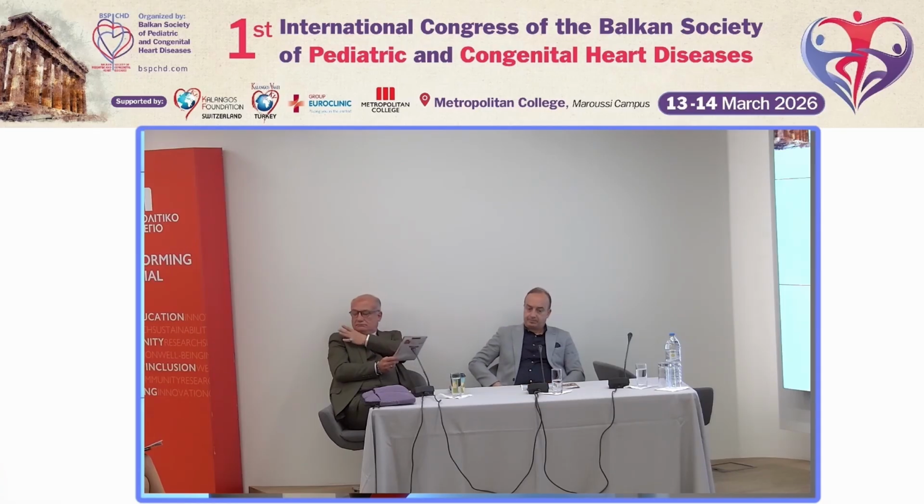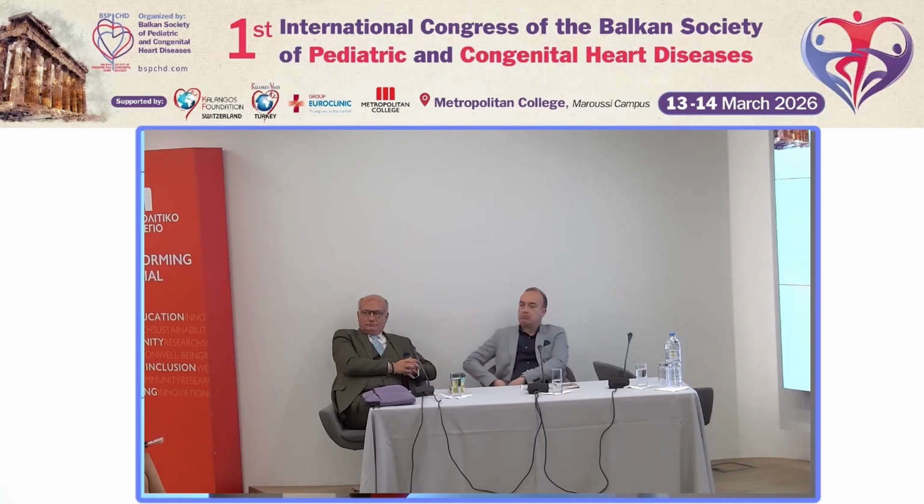And the real strength in this current era, because a lot of my presentation was about future direction and how 4D can lead us to a more tailored approach. But in this current era, it is mostly used in patients where you can have it, and in most centers that would be above the age of 12. And when you really have a big discrepancy in echo, or you really want to have a good look at the anatomy and you don't want to expose the patient to ionizing radiation. Yeah, I would agree. So then MRI would be certainly considered in the older patients.